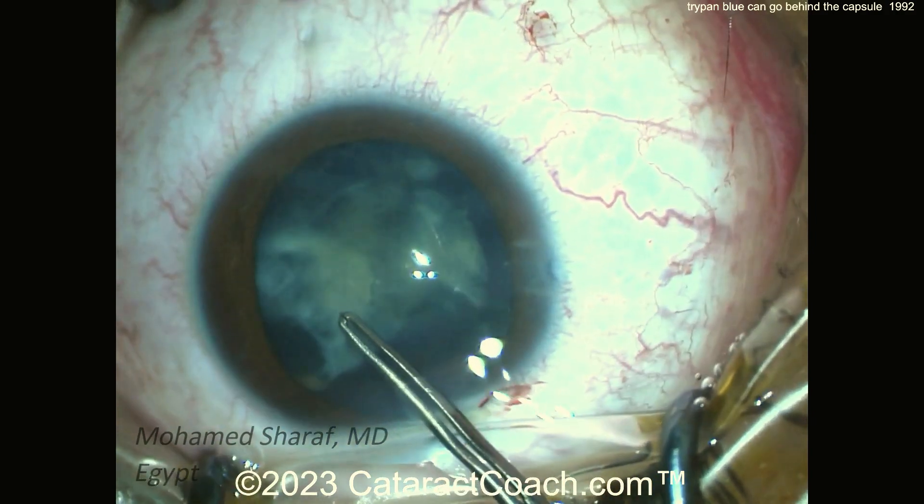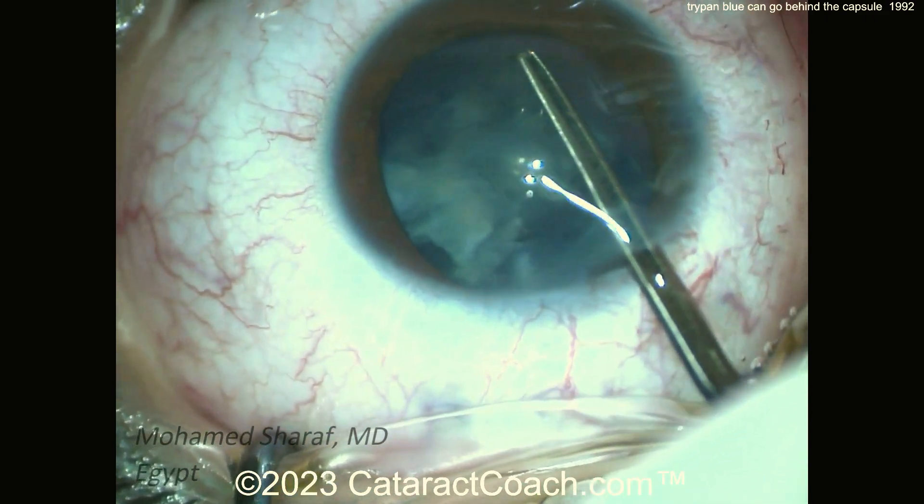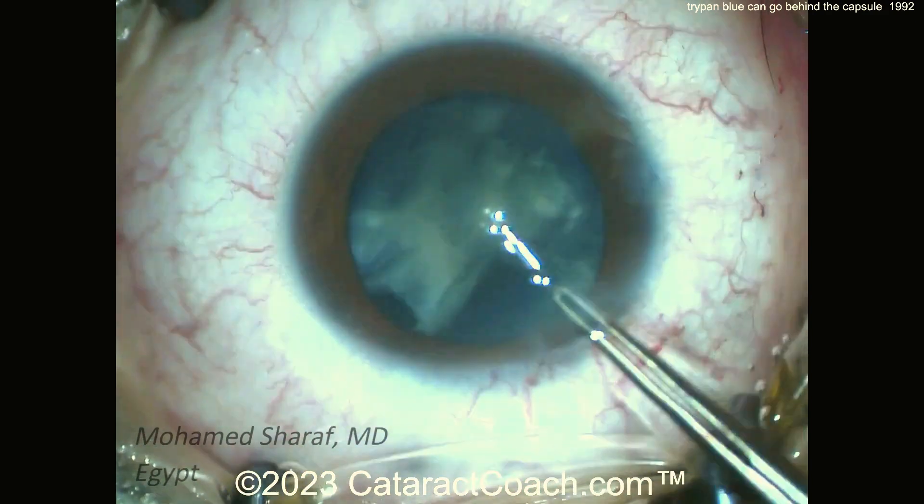If you have that blue dye in the anterior hyaloid face and Berger's space, then you will lose your red reflex, and it becomes very challenging to accomplish the rest of the case.